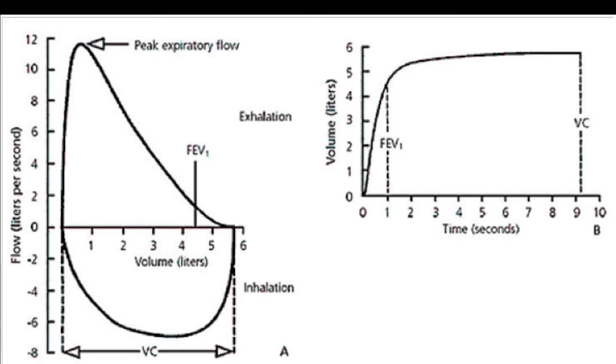Now that we have addressed how to read the graph, we will take a closer look at how spirometry can help us measure one's FVC and FEV-1. We will look at an active demo from participant and good friend, Tom Schrader. Tom is a Caucasian male that is 5 feet 9 inches, 69 inches, weighing around 165 pounds, exercises regularly, and is active at playing men's soccer for Franklin College.